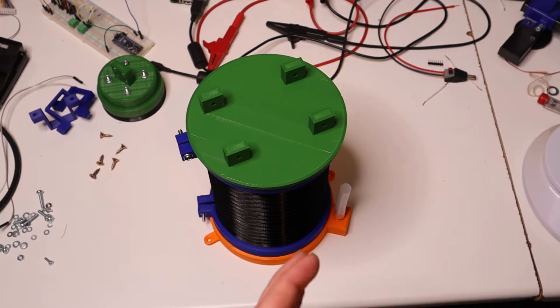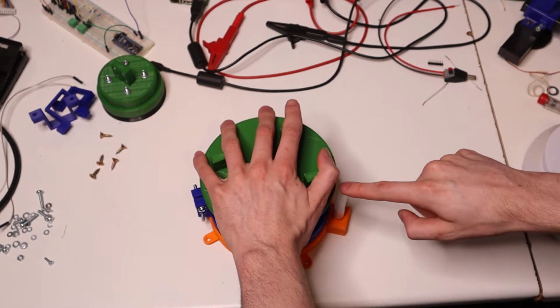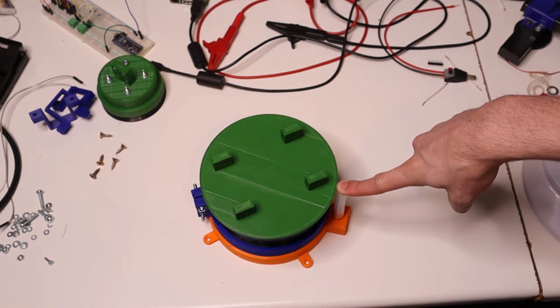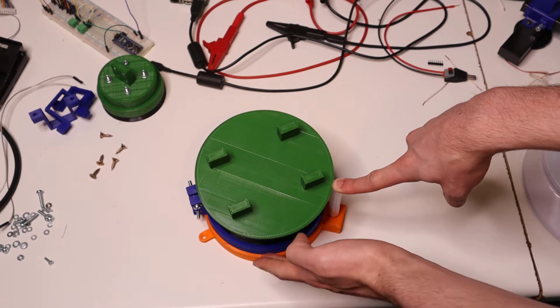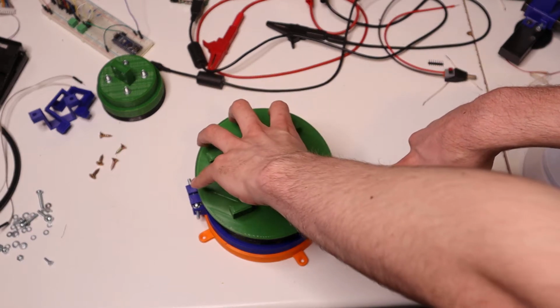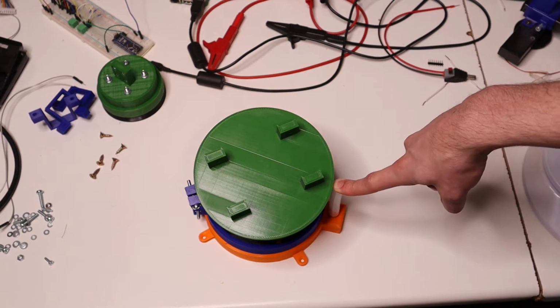Well, the first thing I want to show you is if I compress the bellows all the way and then seal off the exit hole with my finger, you see that it rises very, very slowly. So right now, this plate is being pushed up by the springiness of the bellows, but it's at the same time being pushed down by the air pressure on the outside being greater than the air pressure on the inside.